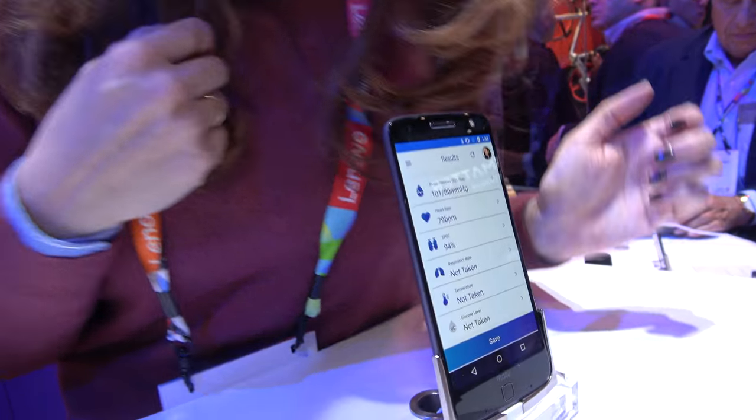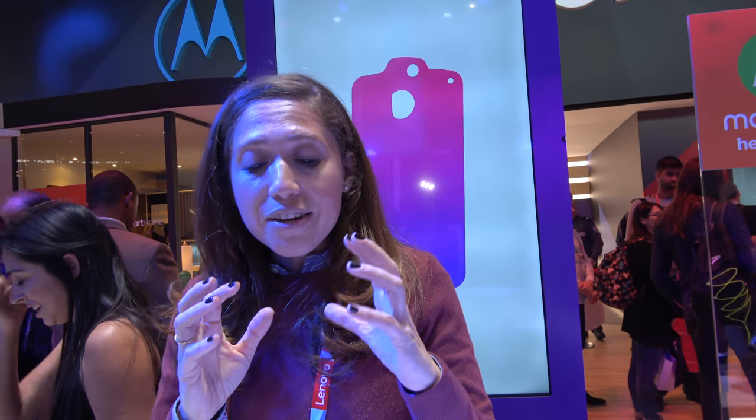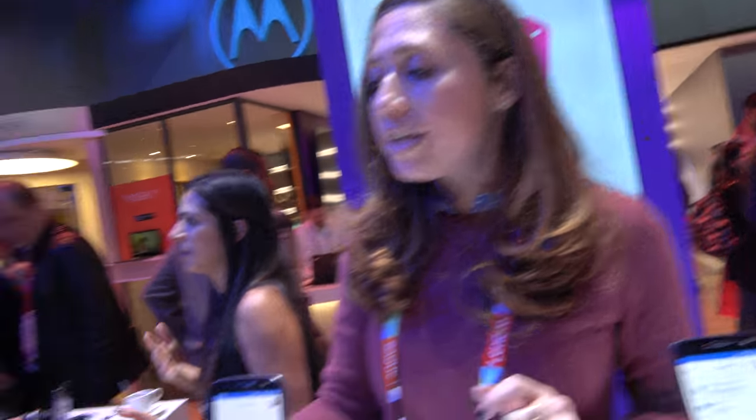So what does it do? It measures your blood pressure, heart rate, respiration, SpO2 — which is the Pulse Ox, meaning how much oxygen is in your blood — as well as your temperature. So essentially you're getting five vital signs in one integrated device.